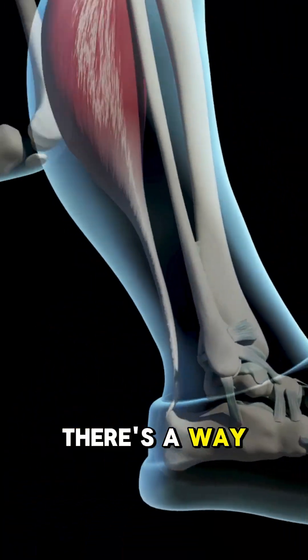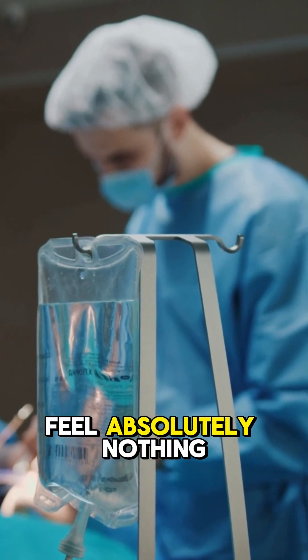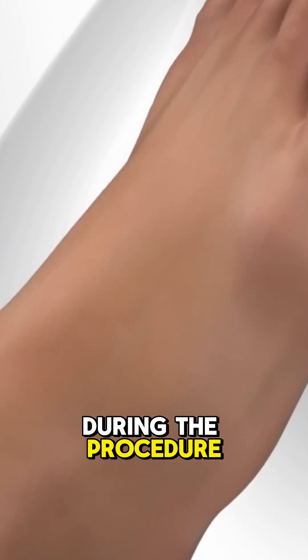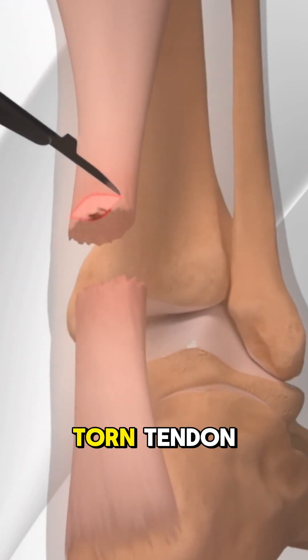But don't worry, there's a way to fix it. First, the patient is given anesthesia to ensure they feel absolutely nothing during the procedure. The surgeon then makes a small incision along the back of the ankle to access the torn tendon.